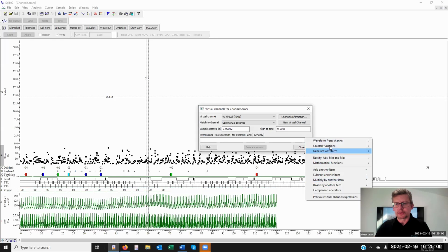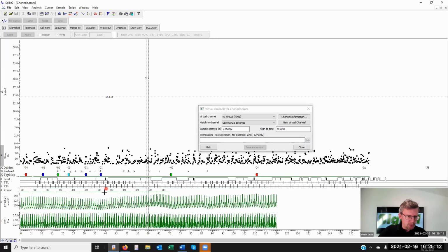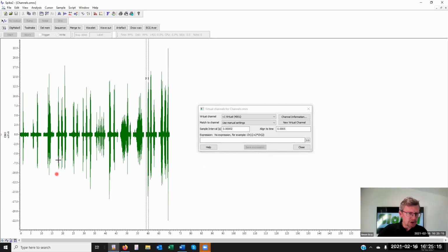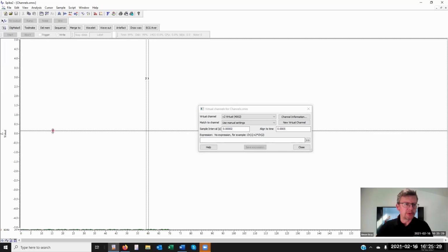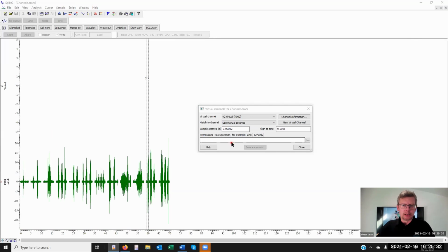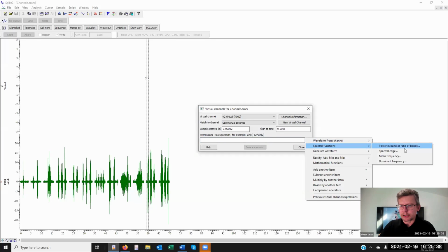Now, more interesting for a lot of you may be the spectral functions. So let's try with the channel 3 here. Now I'm going to ignore my original channel 1, V1 virtual channel, and create a new virtual from it. Let's just open this out a bit so we can see more clearly what's going on. Now, if I create spectral functions, I can look at dominant frequency, mean frequency of the waveform, spectral edge, or power in bands, or ratio of bands. Now this is EMG, but let's consider it EEG for a second.